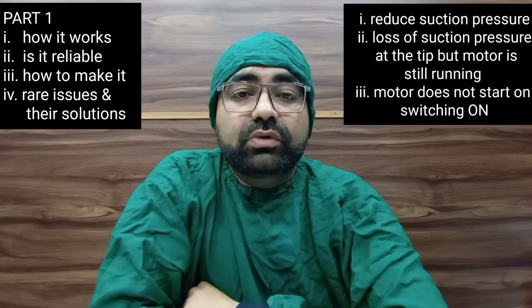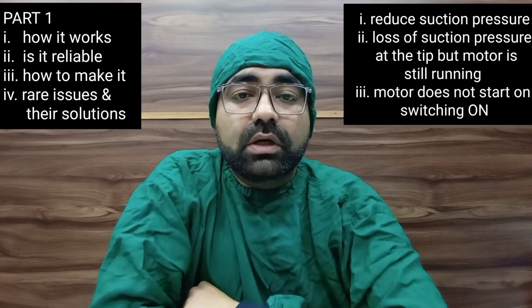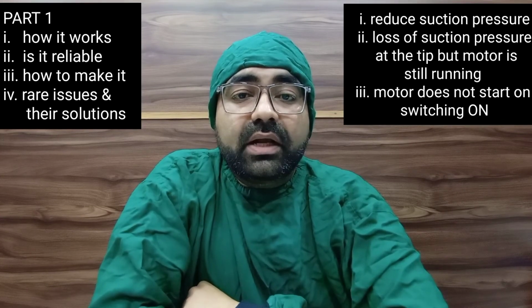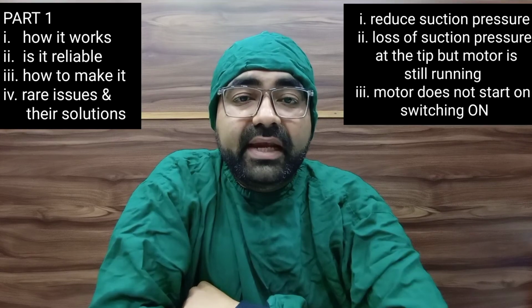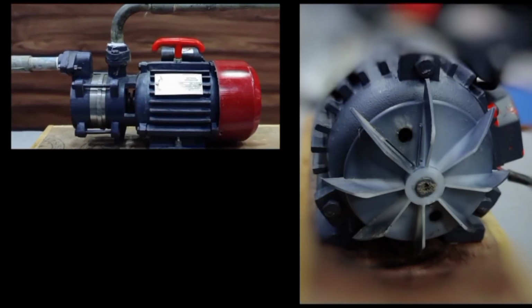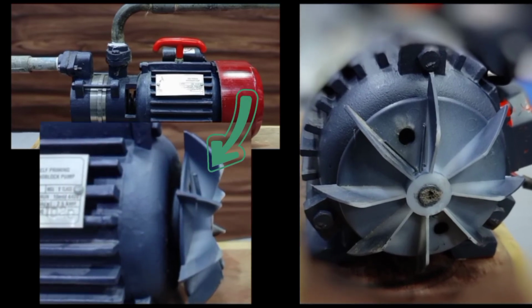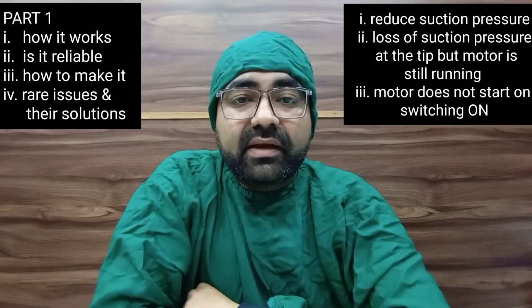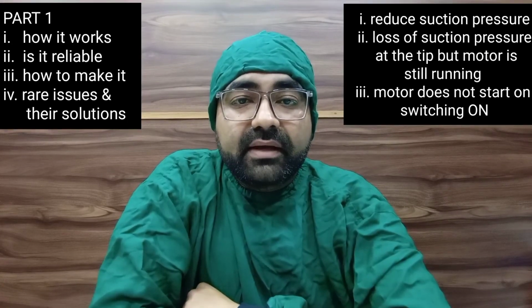Third, the motor does not start on switching on. This happens due to thick residue fluids in the motor core. Blood clots and debris don't allow the motor to rotate freely. To solve this, you just need to rotate the fan at the end of the motor pump anti-clockwise. A gentle push to this fan will start the motor again.